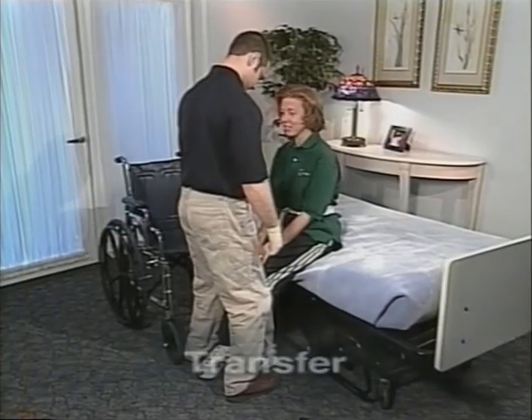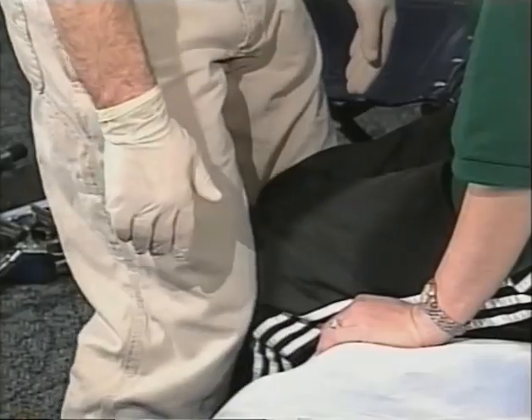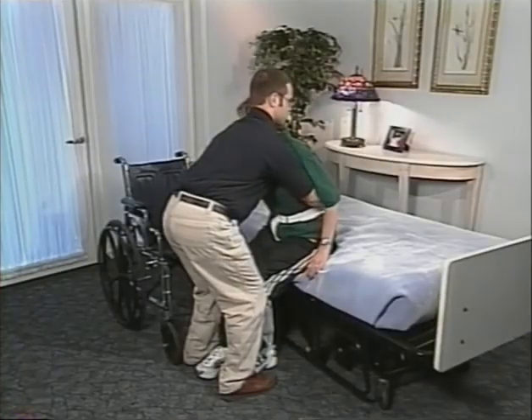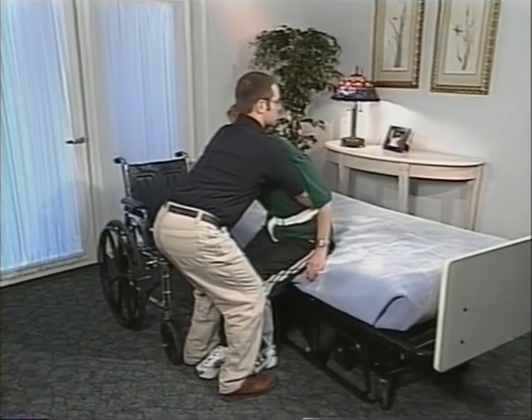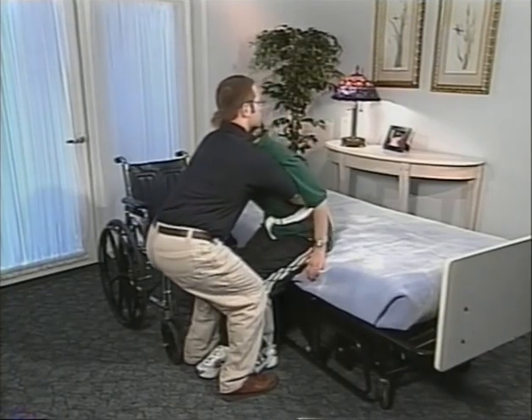Once on the edge of the bed, the actual transfer will begin. Place your feet outside of the client's feet. Contact your knees around the client's knees, holding them in place to prevent them from buckling. Grasp the transfer belt around the client's waist. Remember the 4 B's. Base of support is wide, back is neutral, bent at the hips and not the spine, and body-to-body contact. Count to 3, and on 3, perform the following motion.